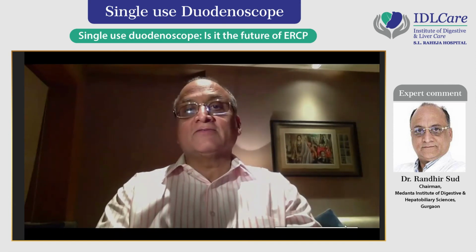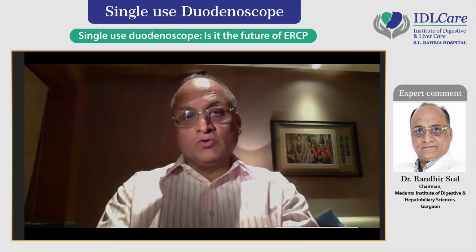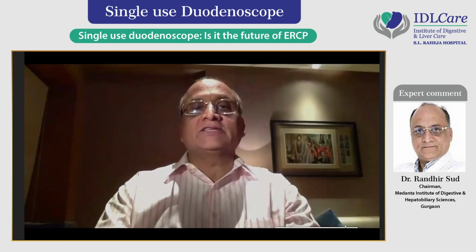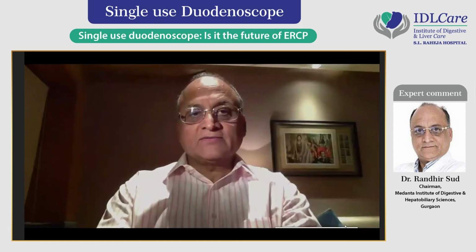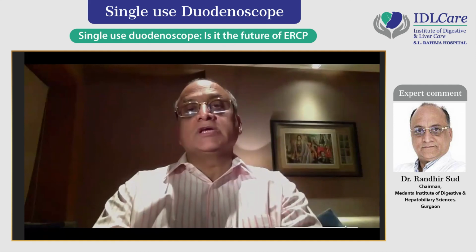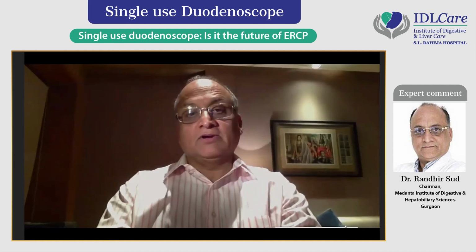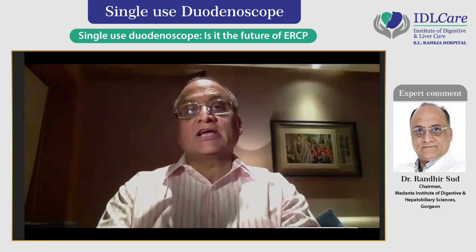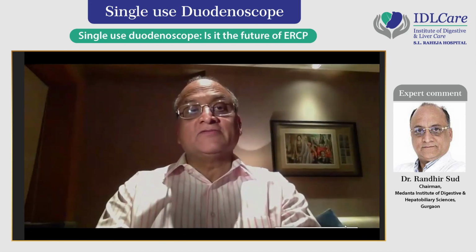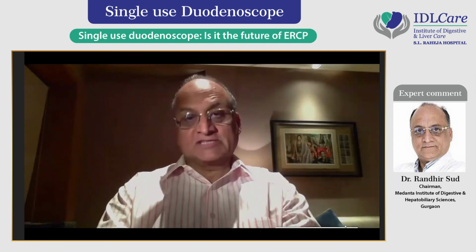So I'll leave you with the thought that we do need better sterilization techniques and better design of the scopes, if that can be evolved, and single use is a very good addition for select patients, unless the cost becomes such, and the method of disposal of the device becomes such, that it does not add additional biowaste. Thank you.